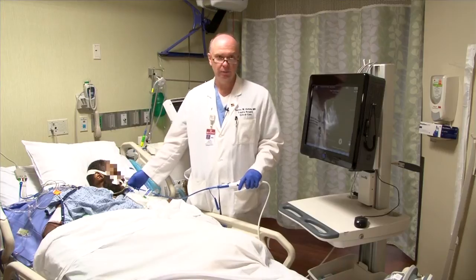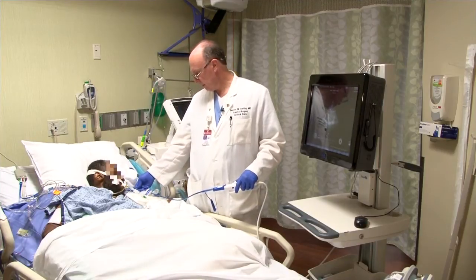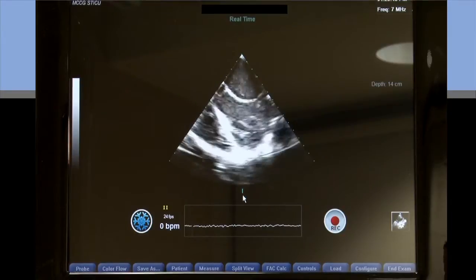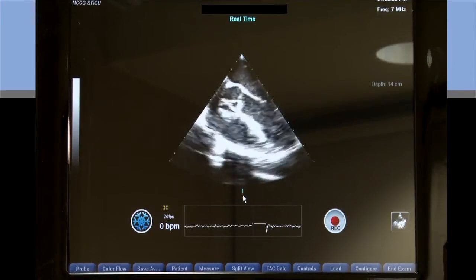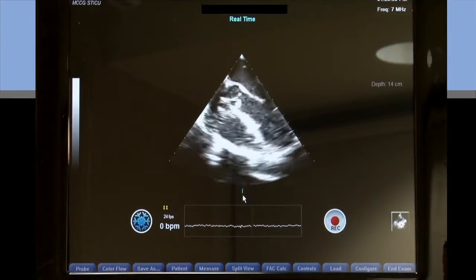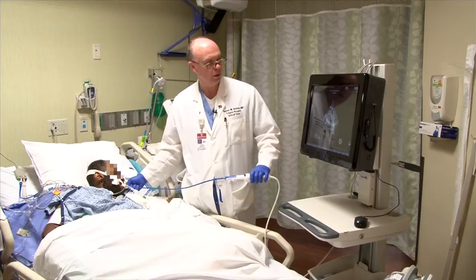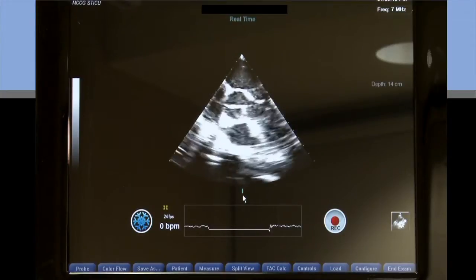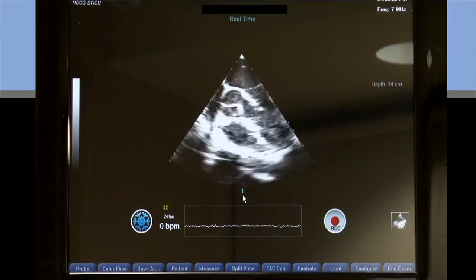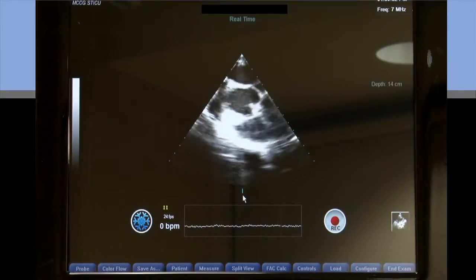Now we're going to be looking for the SVC view, and again our aortic valve is going to be key as a landmark to find the SVC. I'm at approximately 20 to 30 centimeters, and usually that's where we can find the aortic valve. As I manipulate my probe, you can see the aortic valve coming into play. I've made a minor adjustment by taking my hand on the handle as well as my right hand on the probe and rotating clockwise or counterclockwise until I bring the aortic valve into the middle of the field. Now I want to withdraw a little bit more until I get into the ascending aorta, which will put me in good alignment to start looking for my SVC. I'm withdrawing now and you can see the ascending aorta becoming more round in cross-sectional area.